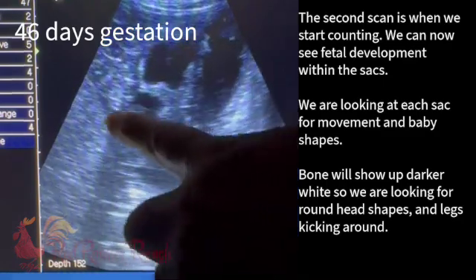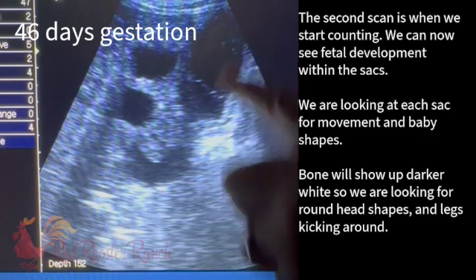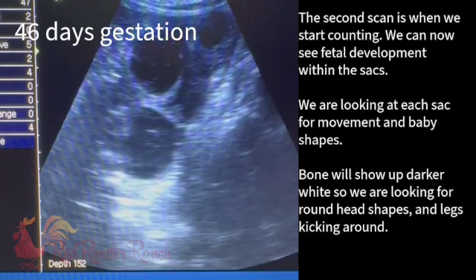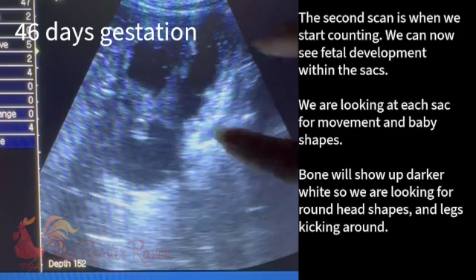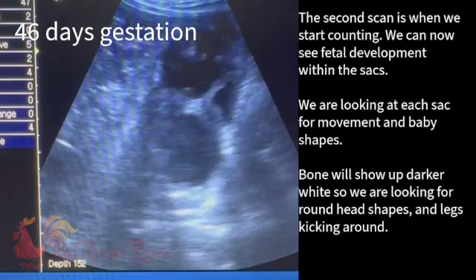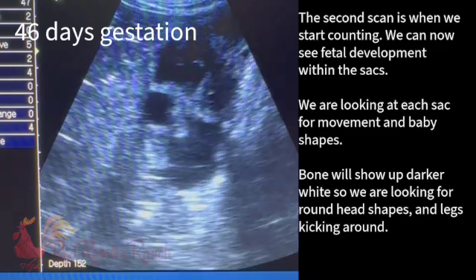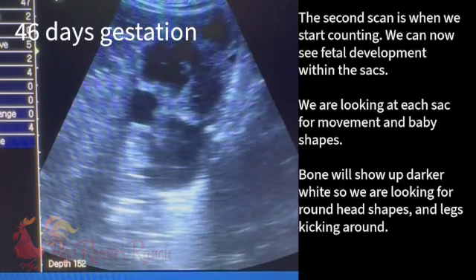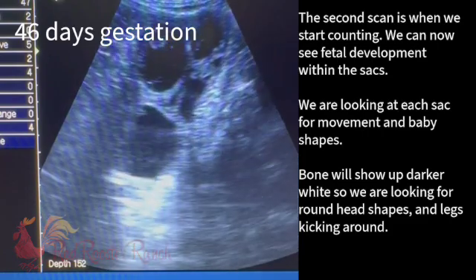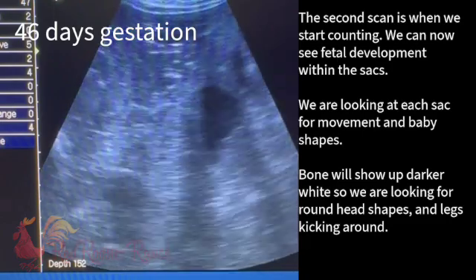I'm going to stop pursuing that. I'm going to do one more scan in two weeks. I like to try to get all three of those on the screen at one time, to see if there's a depth where we can see all three. Because it's fun to be able to see all three at the same time and really confirm those are three separate babies.